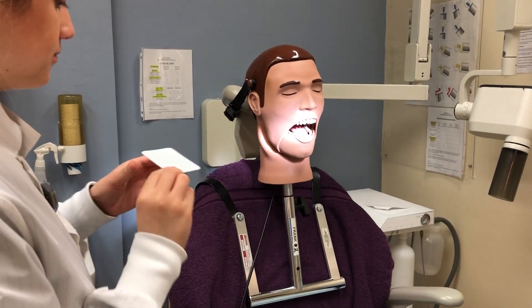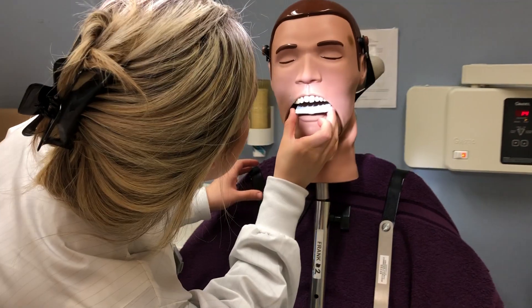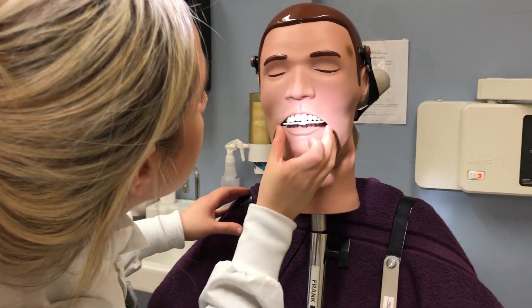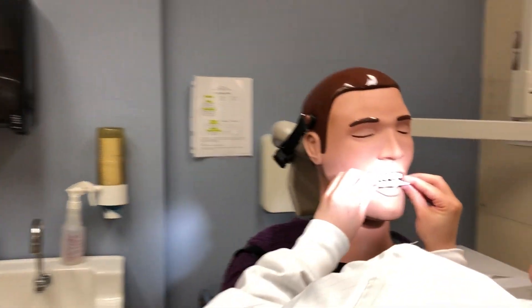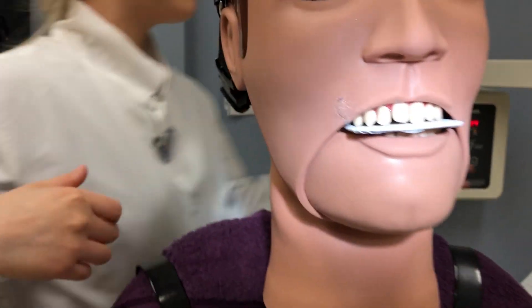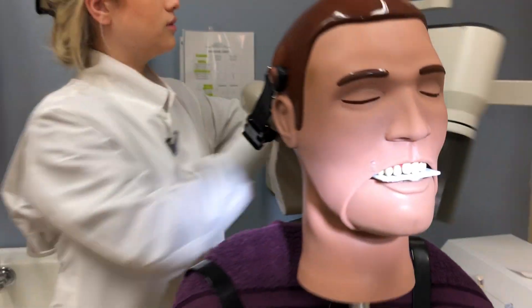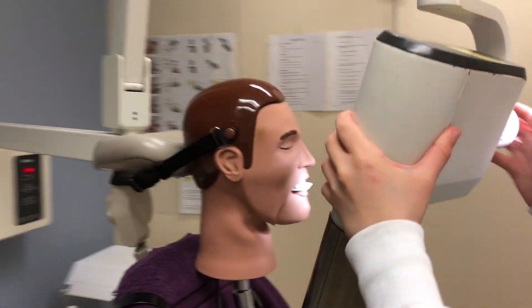For our permanent dentition we are going to use the size 4 film, and we're going to make sure that the white side is facing upwards for this projection — and he looks all set. Make sure that your PID is set to a positive 65 vertical angulation.